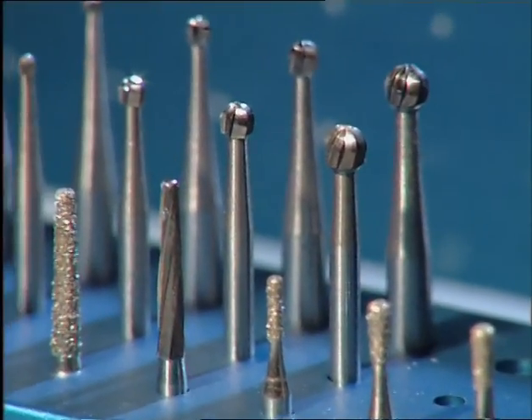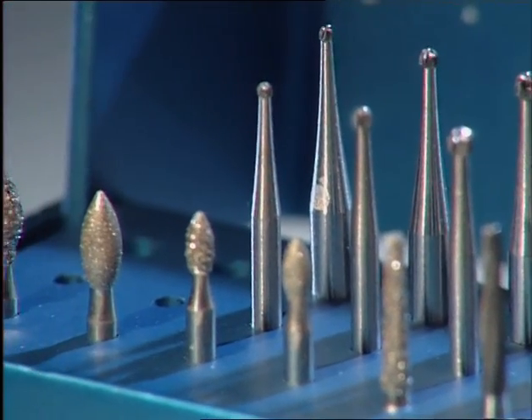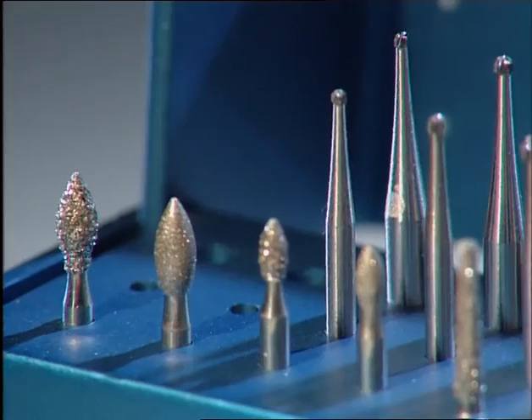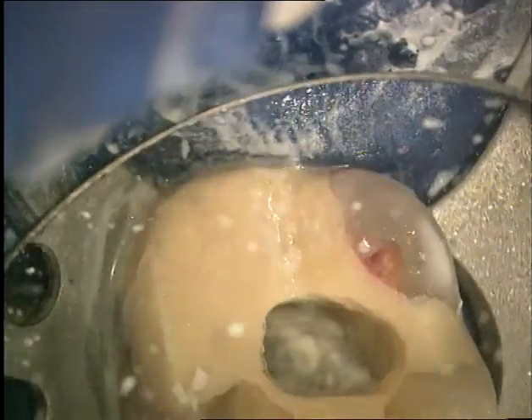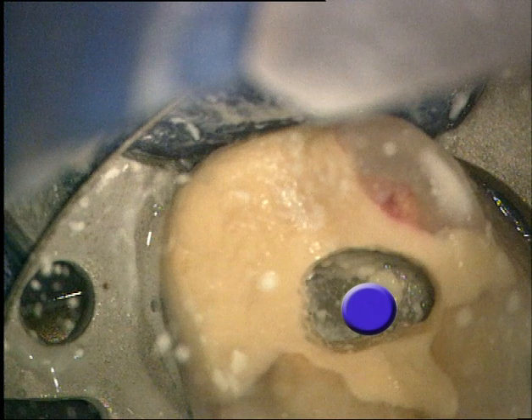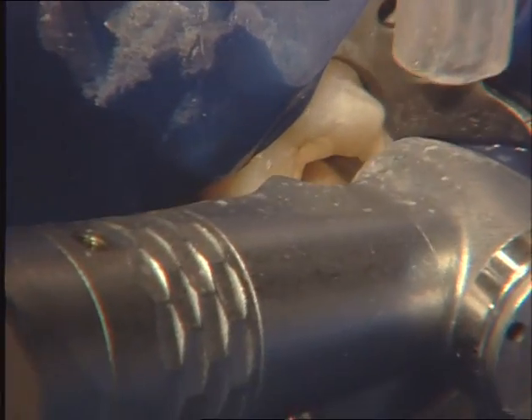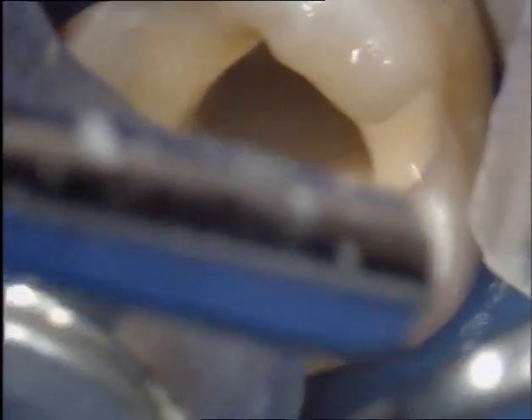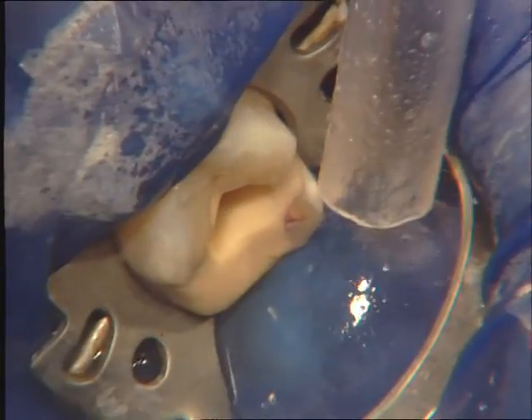Long-shank round burs are used to improve the view for the operator. The initial penetration of the pulpal roof is localized in the center of the central groove, with the bur inclined slightly towards the mesiobuccal cusp. In order to get a straight line access to the mesiobuccal root canal system, the walls of the access cavity should be inclined slightly towards the buccal and the mesial.